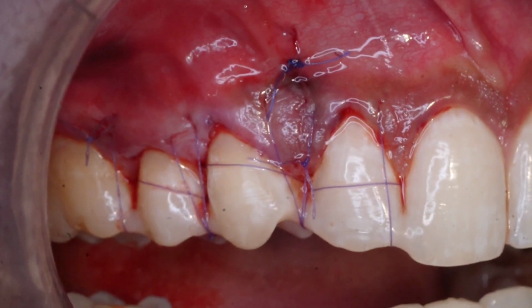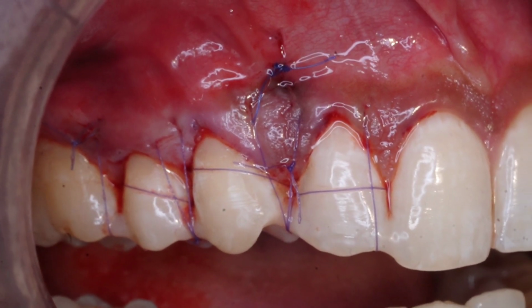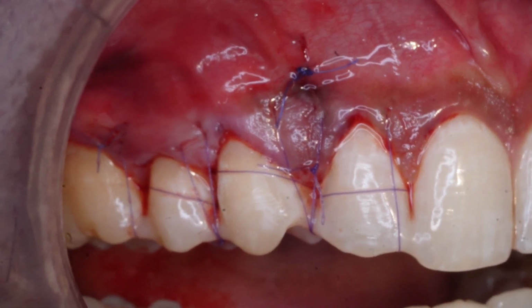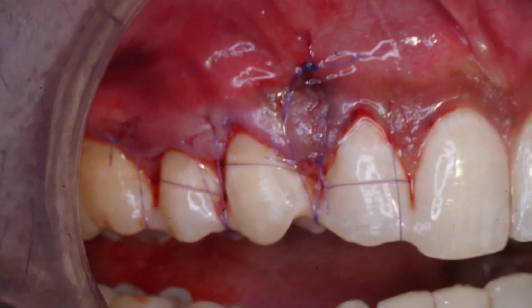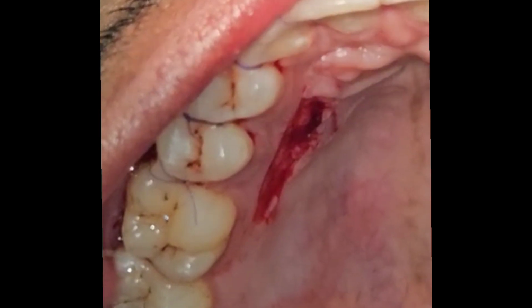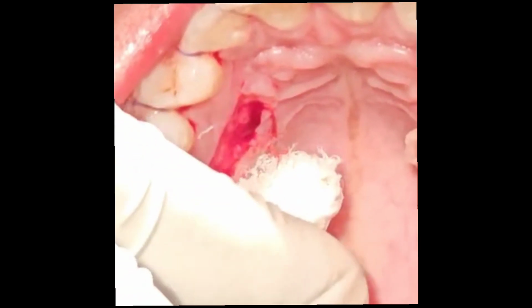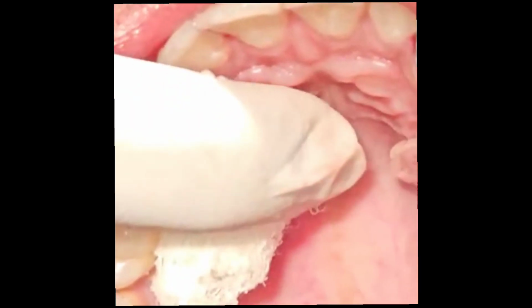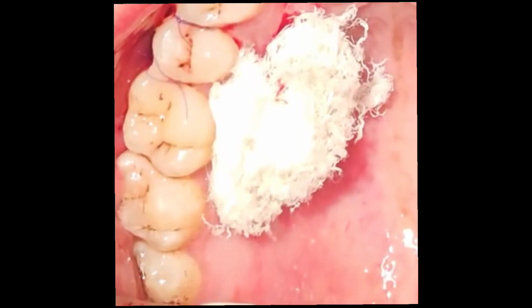So one can use a variety of techniques like sling and tag, or sutures like belt and suspender sutures. In this case, we are using suspender sutures which are anchored over the interdental composite stops. The vestibular incision is also sutured. For the palatal donor site, to prevent any secondary oozing, one can reuse the hemostatic collagen fiber or any other biomaterial and cover it using an acrylic plate if needed. The fiber can stay on the donor site.